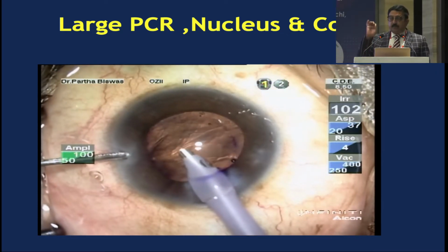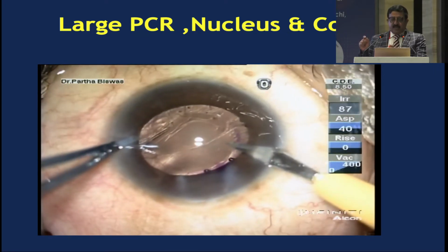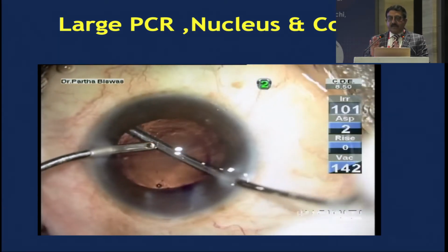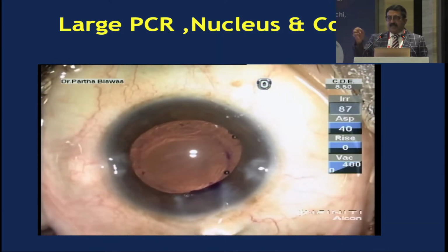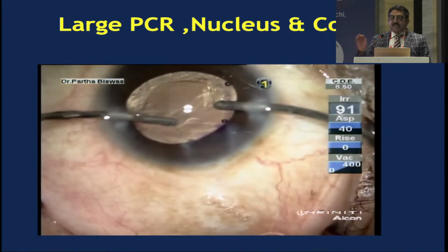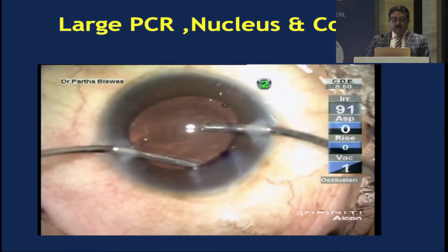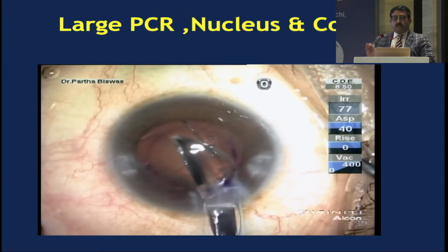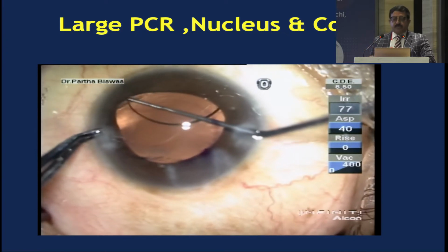Please remember, the moment you feel that vitreous is there, put in a little more additional viscoelastic, stain, do anterior vitrectomy, and get all vitreous out of the way. Then again you can go ahead and take off wisps of cortical matter if necessary. Here in this case, vitreous has not shown, so we are able to take off the little bit of cortical matter. However, please do not rely upon your naked eyes or the microscope that you're using. You have to use triamcinolone.